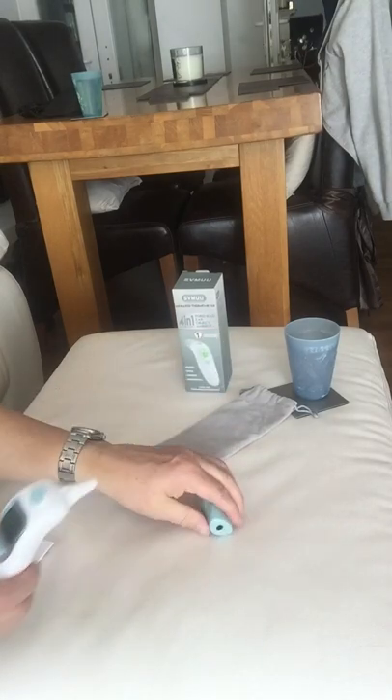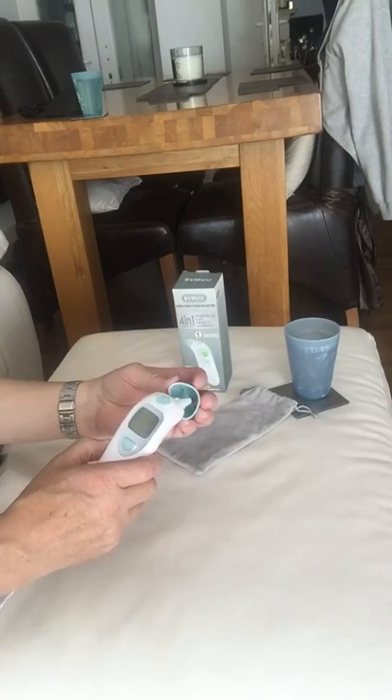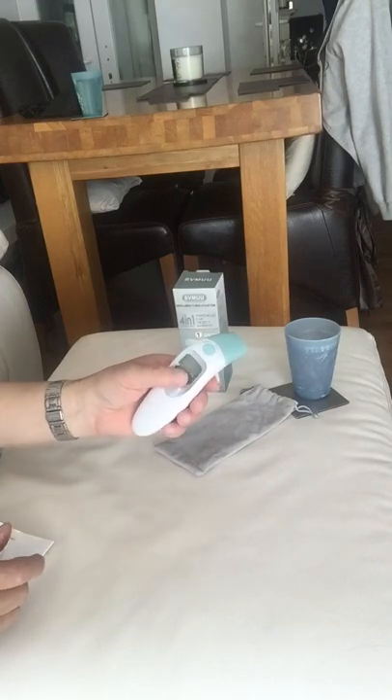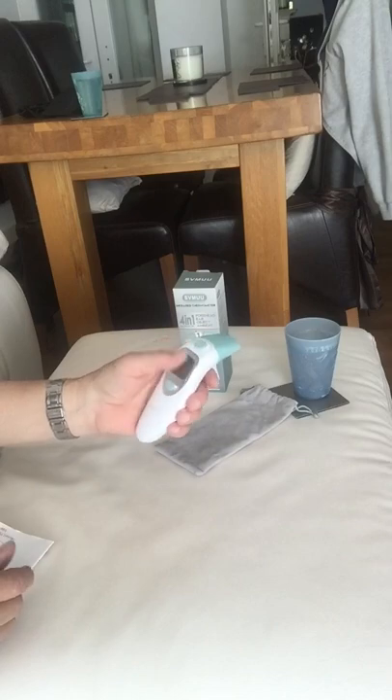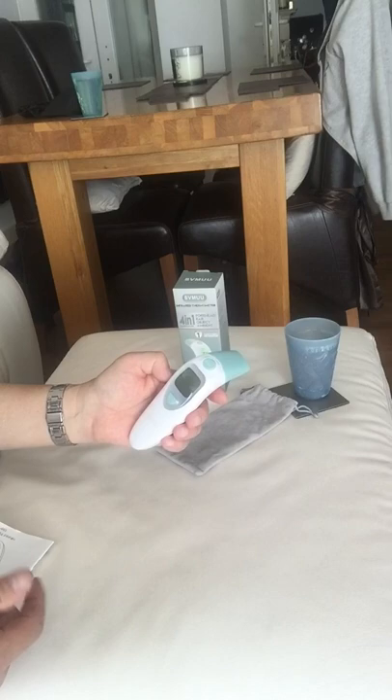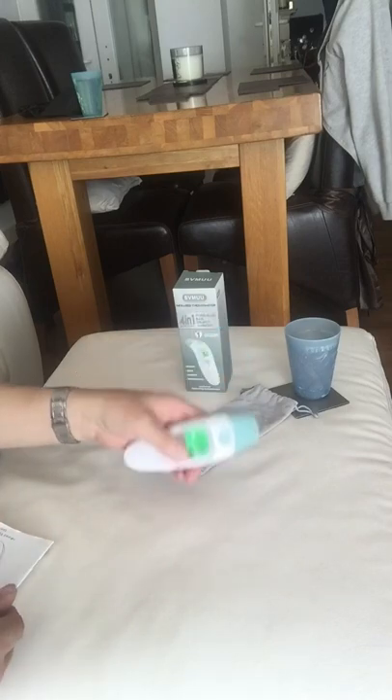I think every household should have one of these — it's a superb product. We have a quite sick child and it's nice that I can just pick this up and check the temperature within a few seconds. It's easier than putting a thermometer in your mouth or armpit, or using magnetic strips that just change temperature as you move them around on your forehead. It's a superb bit of kit.